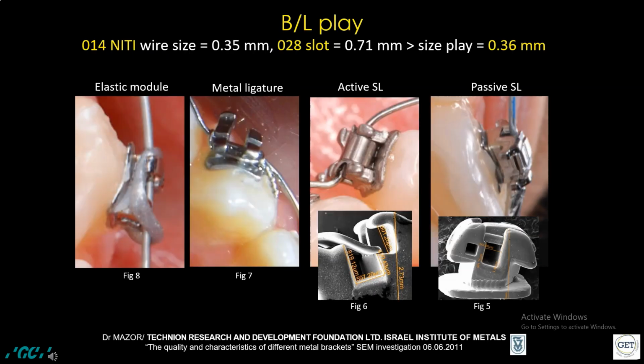In the following slide, we can see 4 types of ligations. Each one of them will express differently the control of the tooth movement and position. The ligature wire, Fig number 7, can seat the wire best in the bracket slot, pushing it completely all the way in contact with the lingual wall of the slot, fully correcting the tooth position. But since a higher friction can be developed if the same ligation is used in all brackets, the overall developed friction level can be creating a binding, stopping or slowing down very much the teeth movements.